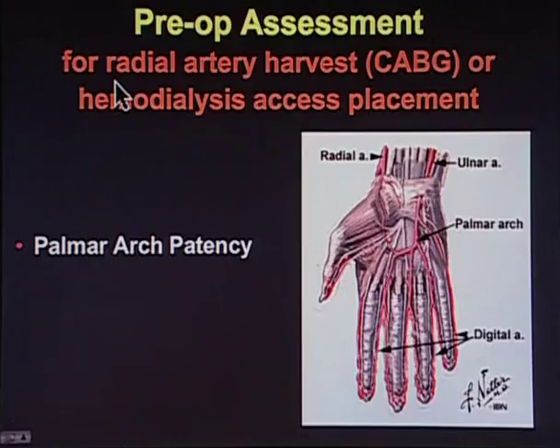Now, another reason for duplex imaging is for radial artery harvest preoperatively to coronary artery bypass graft.